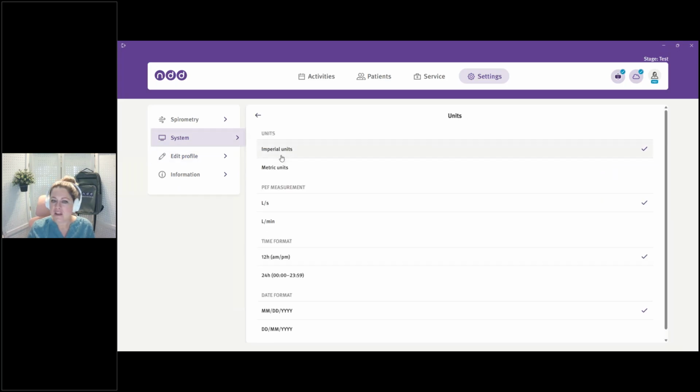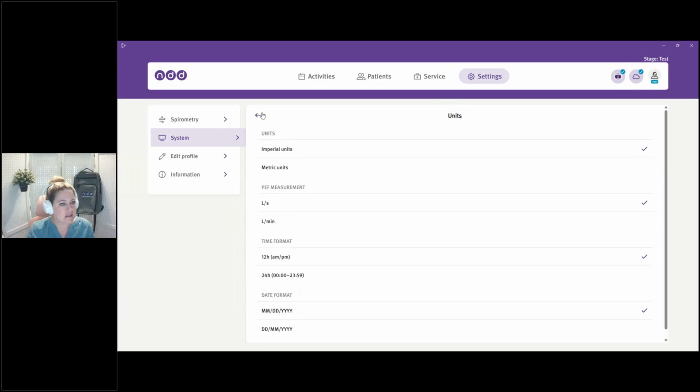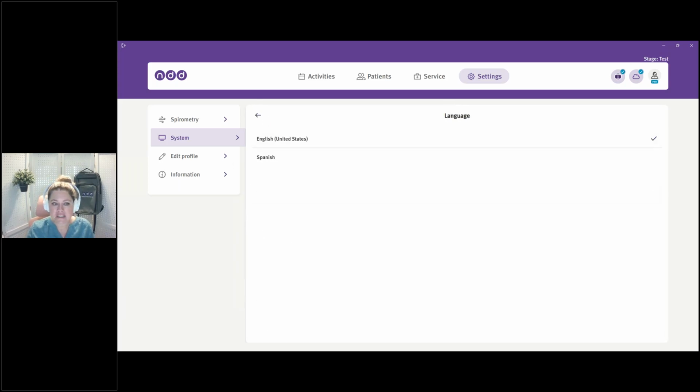Sorry about that. Units is units of measurement. So formatting the device, what units of measurement are we using? Our time format, our date format. The system language, again, right now, only English and Spanish are available.